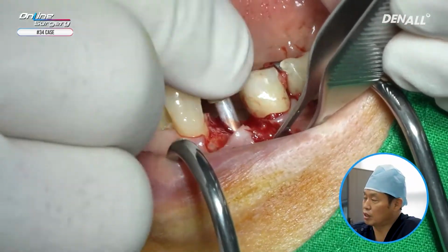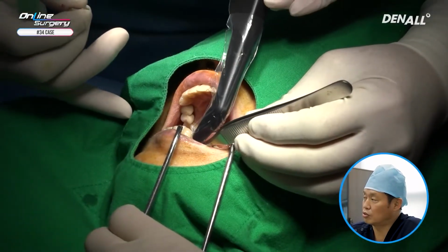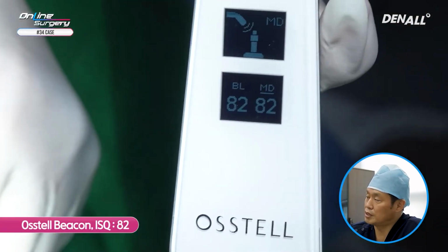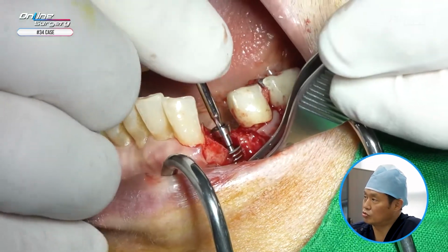Smart peg is connected. I'm going to check stability once again. I'm going to check the ISQ value. It's approximately 82. Primary stability is good.